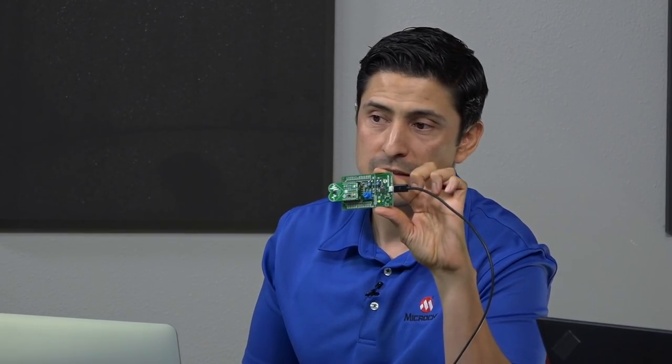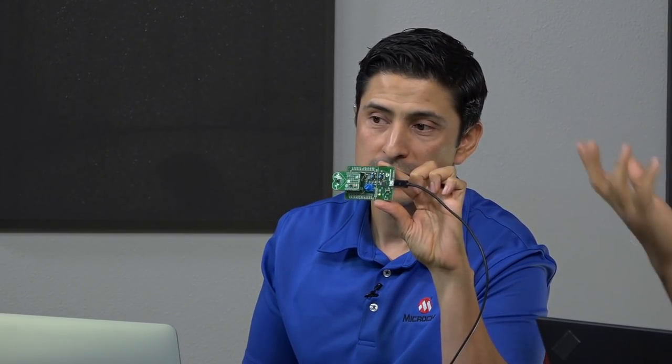It's just programmed. And you can see, so now this is ready to use. Yes. Now you can see right there there is an LED, and that LED turns red for a fraction of a second. That's how long it takes. I don't know how well it can see. Yeah, it's kind of hard to see. But yep, and then it should be done.